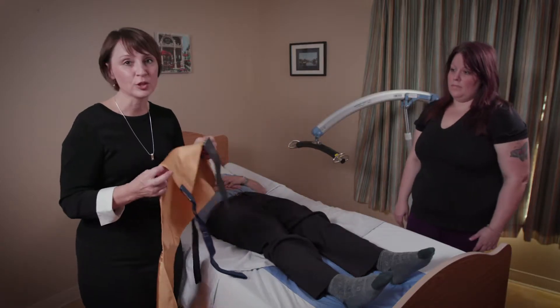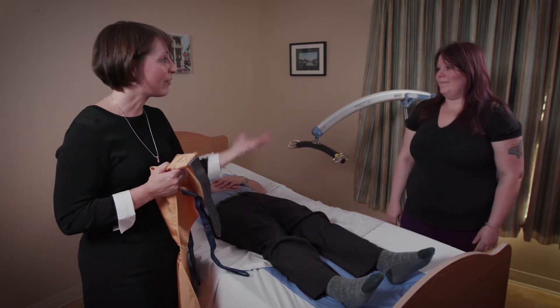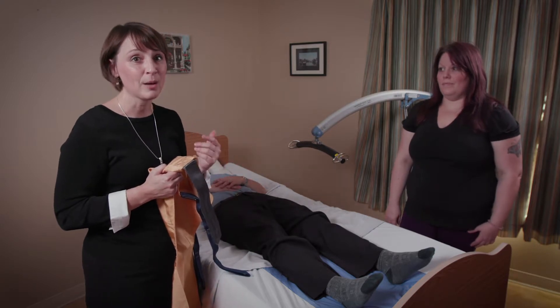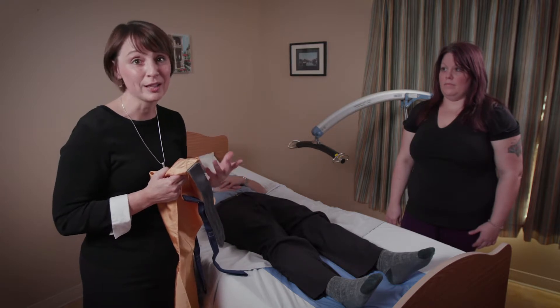So this is our sling, and in order to use the sling we need a piece of equipment. We have a portable lift. We have Ashley helping out, because we always know we need two people when operating a piece of equipment to lift any part of a client or the client themselves.